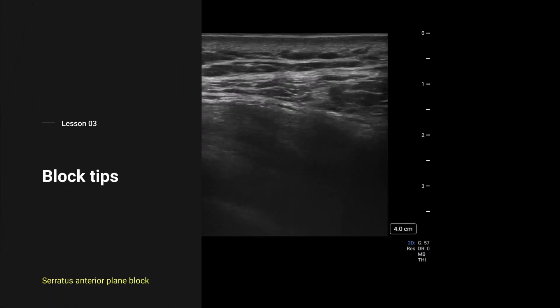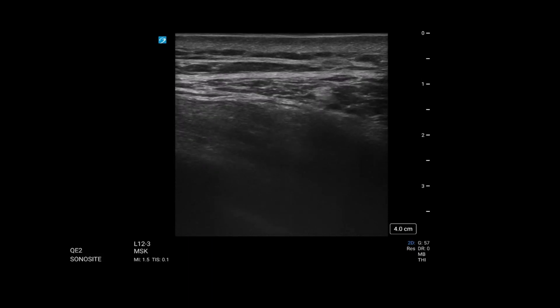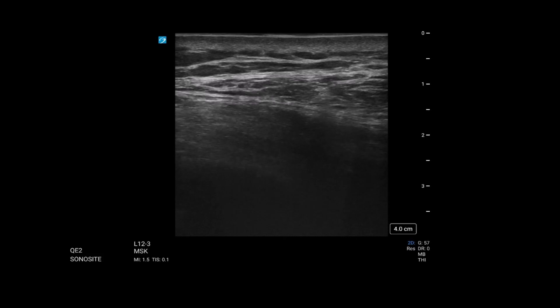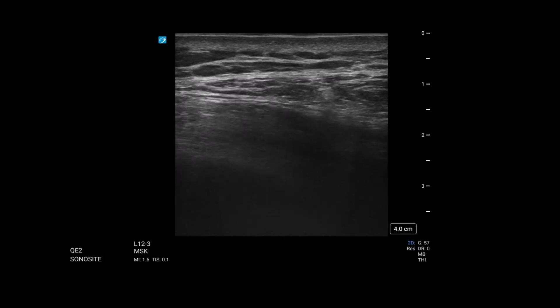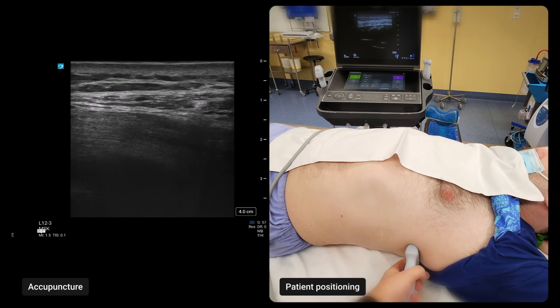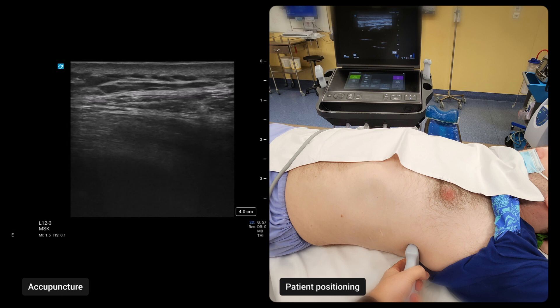Okay, so finally we get to the fun stuff — let's look at some blocks. We've got the patient supine with their arm outstretched. We're doing a single-shot serratus to help us position laterally so we can do a paravertebral — similar to doing a PENG or fascia iliaca before a spinal in a fractured hip. We can see straight away a couple of landmarks: some subcutaneous tissue, the latissimus dorsi which looks triangularly shaped, and then under that it's a bit mushy and grey. We can see some pleura moving and some ribs. We're going to approach quite superficially and try to pop through.